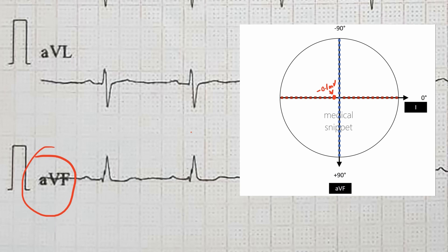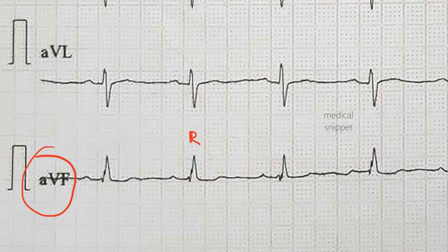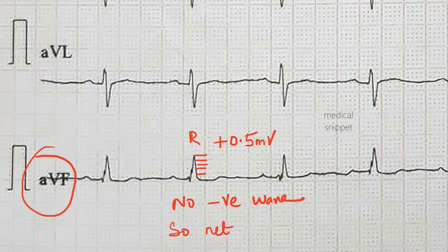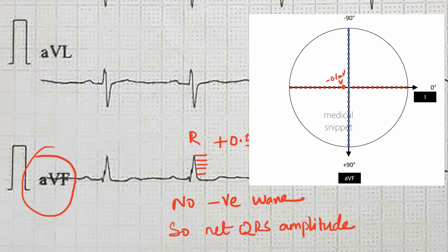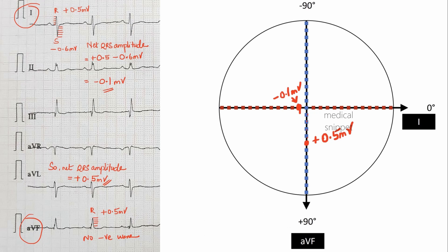In lead AVF the R wave amplitude is positive 0.5 millivolt, and there is no major negative waves. Let's plot it in the diagram. Draw perpendicular lines from this point — the point where they meet is the QRS axis. Here it is more than 90 degrees, so there is right axis deviation.